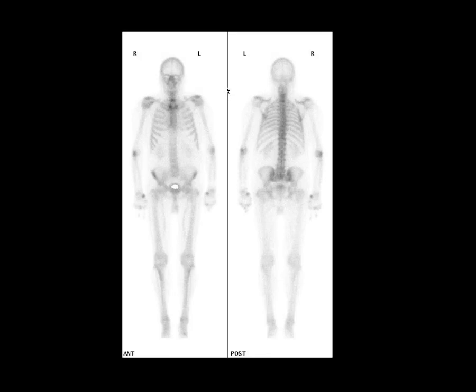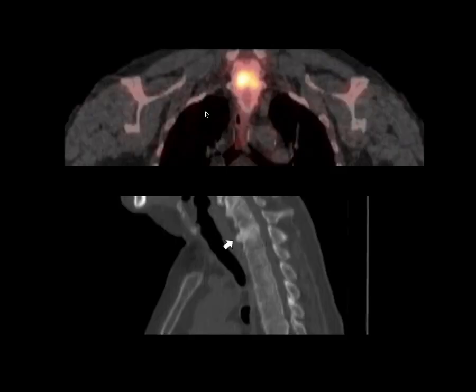This patient has a central focus of activity in the lower neck — not quite the shape of thyroid activity, but not lateral enough to be facet degenerative change. We didn't want to miss a metastasis, so we performed a SPECT CT. The fused image shows activity centrally in the neck, and the CT component shows degenerative change with osteophyte formation. It might cause the patient discomfort, but it's not metastatic disease.